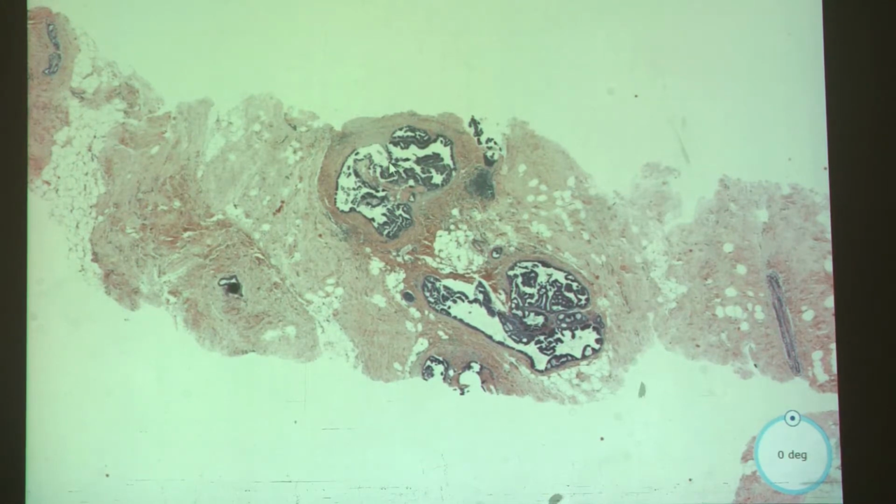So, question. When looking at ADH and they're doing two different foci with normal intervening tissue, when do you aggregate and when do you not aggregate for the purpose of the size? That's actually a really good question, and I think every person, every institution has their own threshold for that. But for something like this, to me, it's one lesion.